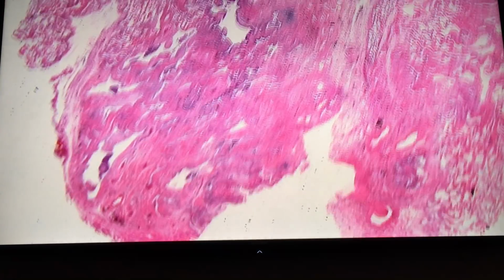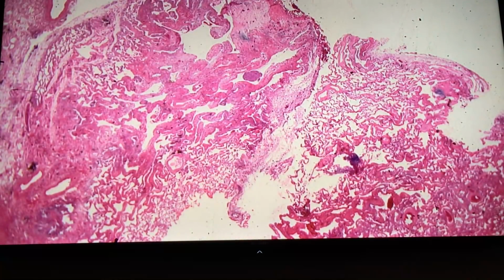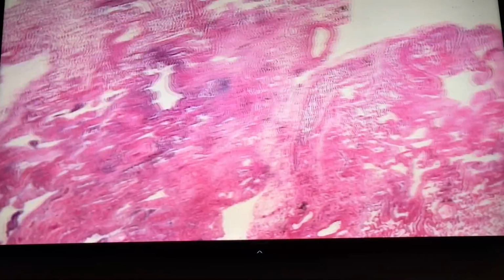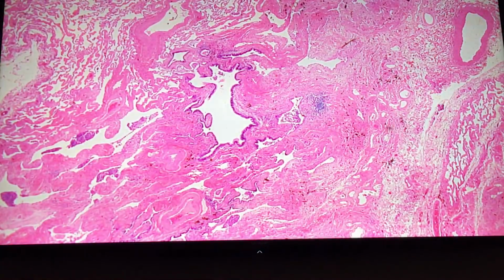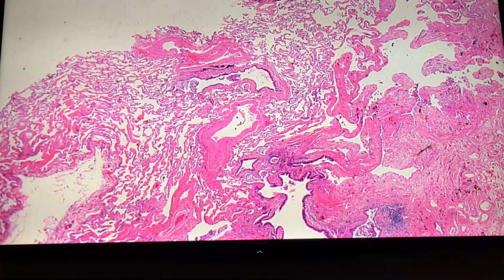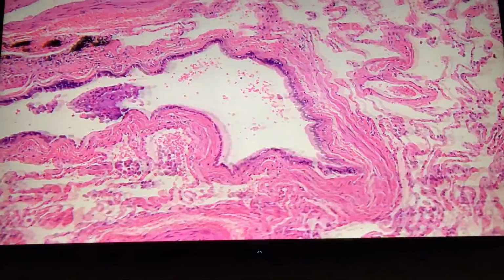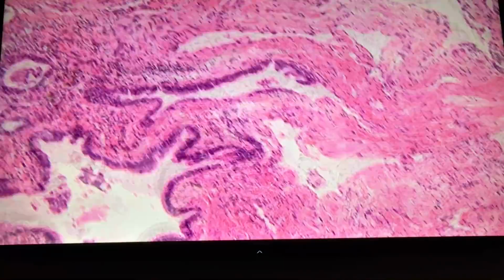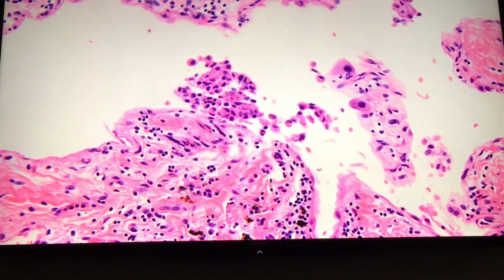Okay, we'll do one more fast and then we can do whatever you guys want for the next. I'm going to be quiet and let's see if you can get this. Aaron, you can go wherever you want. So I want here, guys, a description before you give the diagnosis, okay? I want you to run me through your thought process, whatever you're seeing.